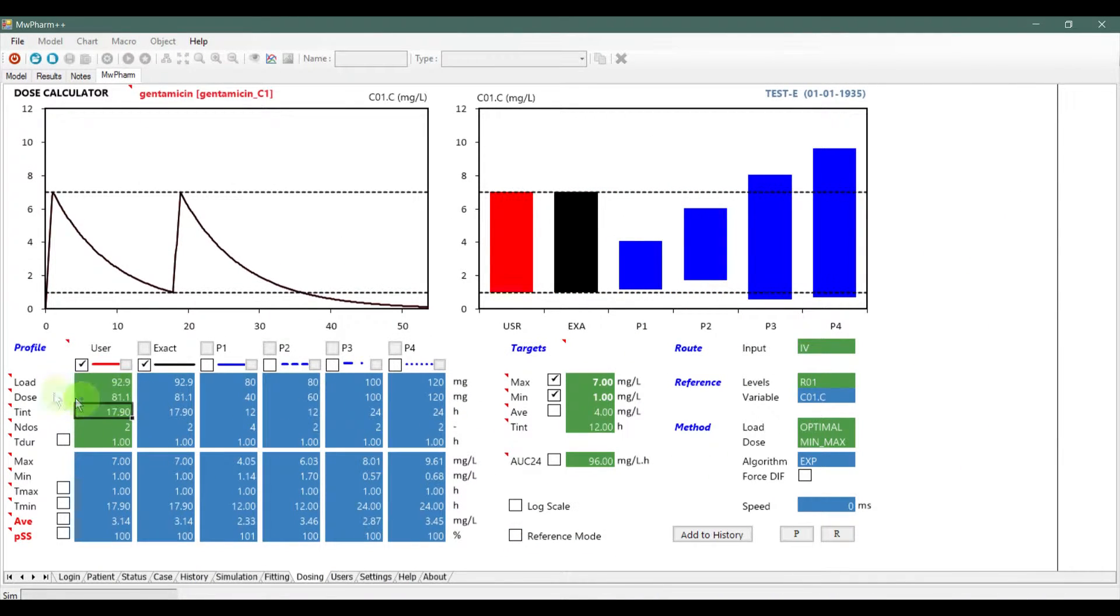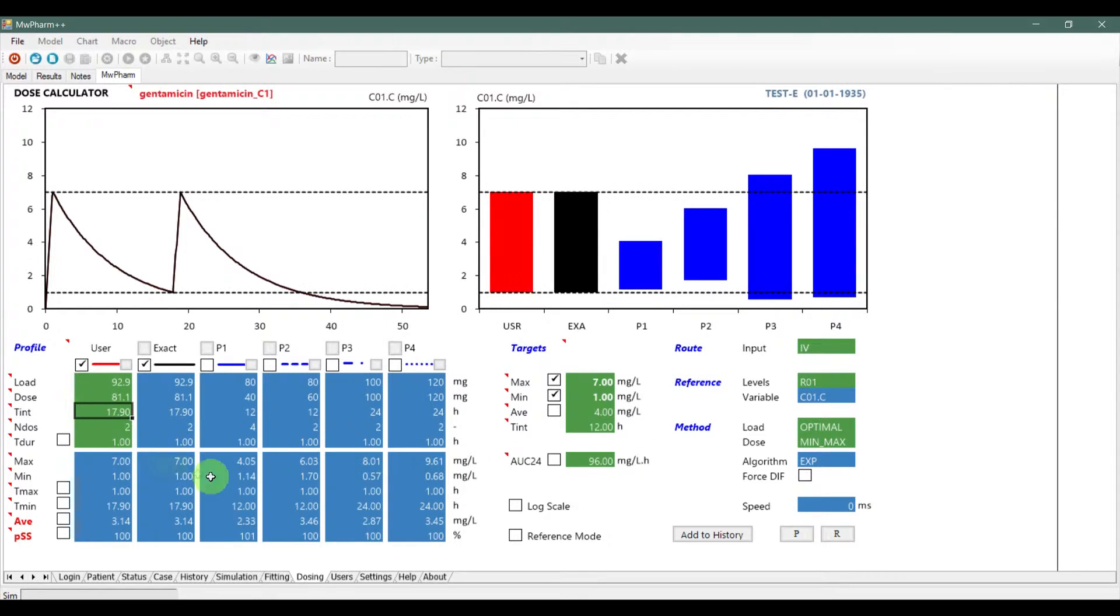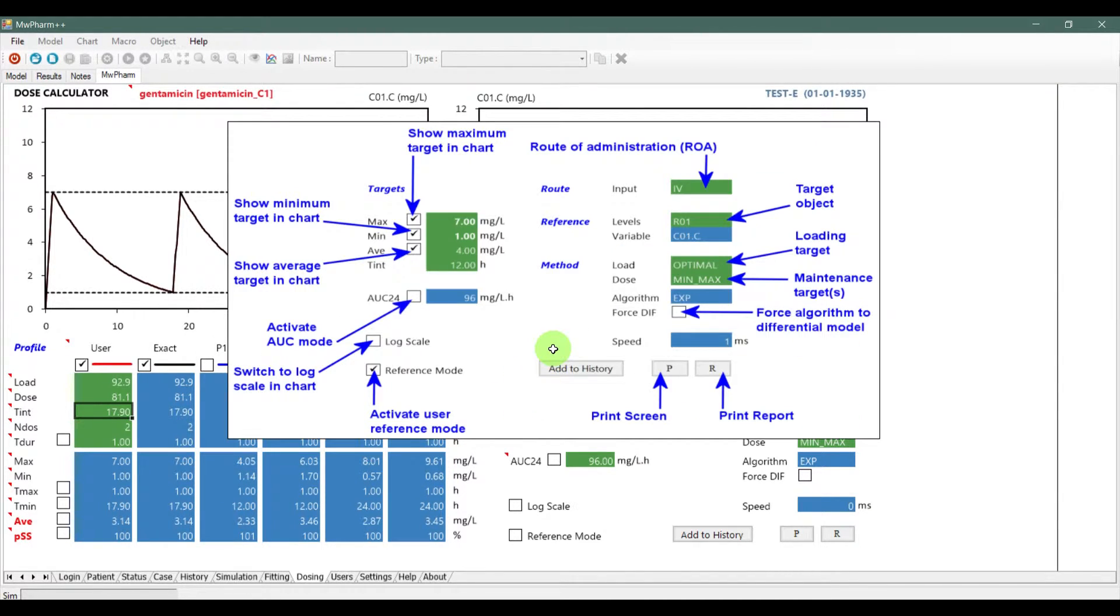If you place your cursor on the small triangle here, you will be offered help about profile sections. Here is the help about the target section.